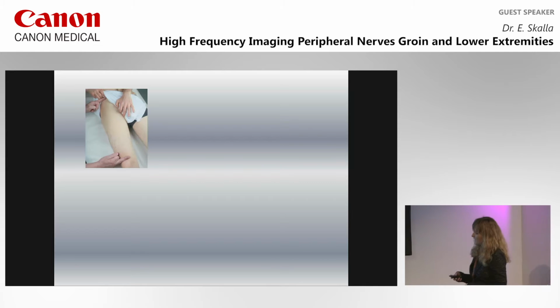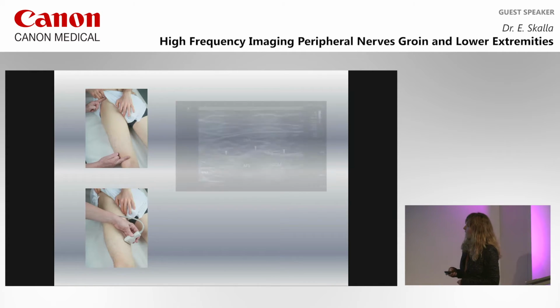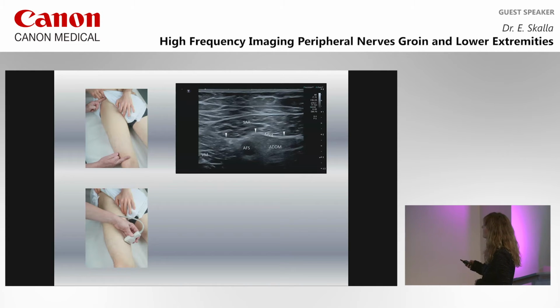So, one step more distally. The first picture I showed you was in this region. If we go more distally, once again we have the Sartorius muscle as our internal landmark. Now we're at the height of the adductor channel. It is bordered by the medial vastus muscle, the Sartorius muscle, here's the vastoadductor membrane, an important structure, this hyperechogenic band, and the adductor magnus muscle.